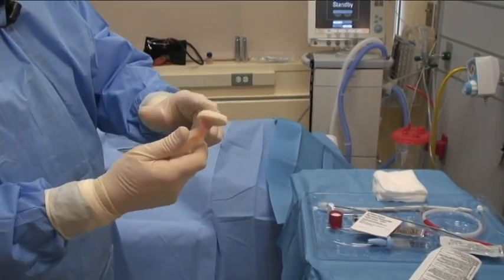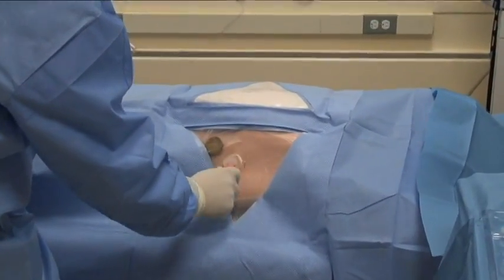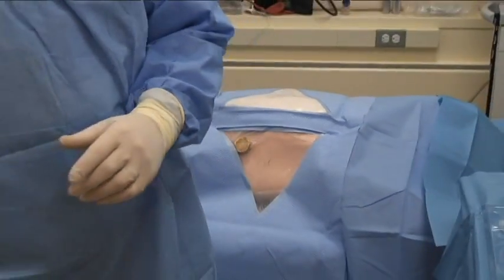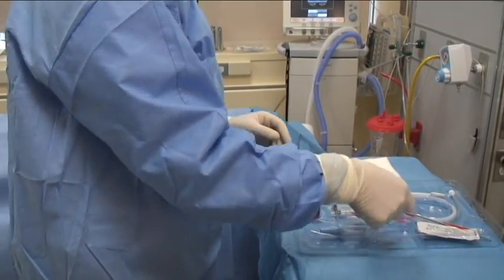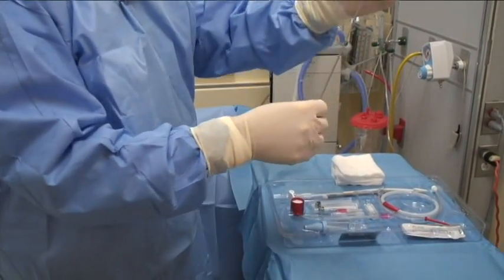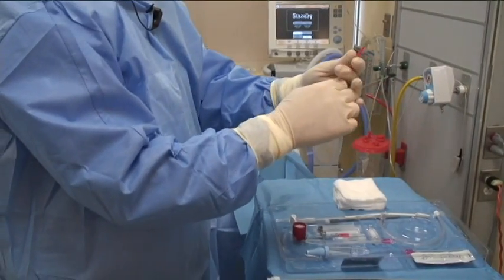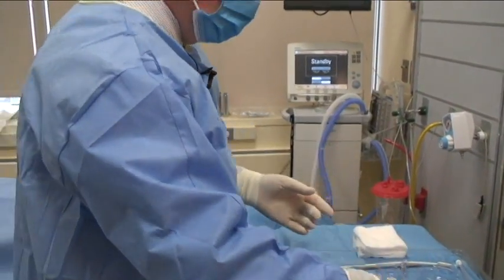Forces the liquid chlorhexidine into the sponge, at which point I can clean off the patient and then discard of the chlorhexidine. Okay, so in this kit we have a plastic trocar, we have a guide wire, which I will make ready to use by straightening out the tip.